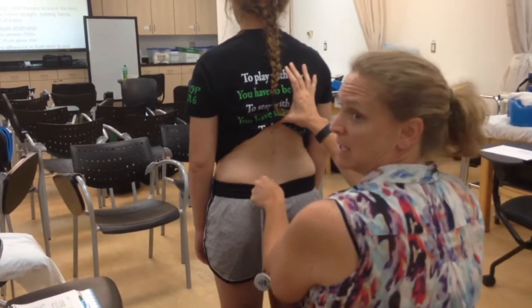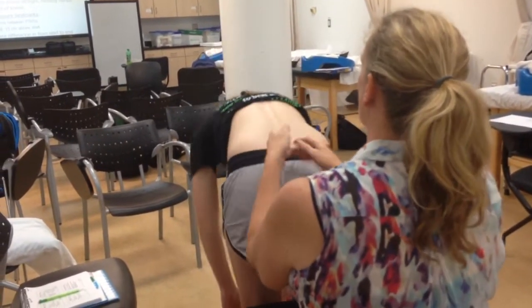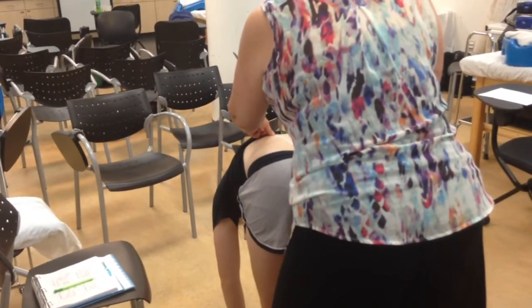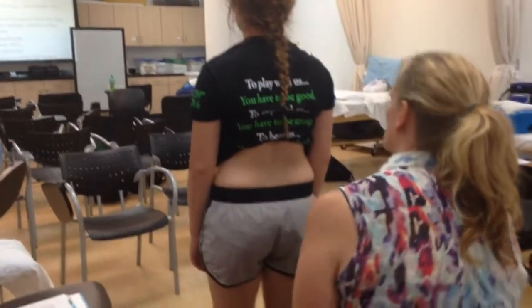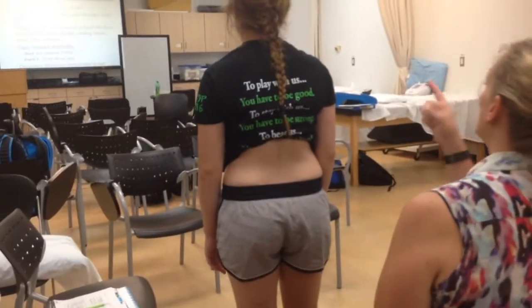I don't need to leave the tape on there. Go ahead and bend forward and touch your toes. Now I'm going to measure — and she comes in at 21.9. So she is at almost 7 centimeters — 6.9. And normal is 6 centimeters.